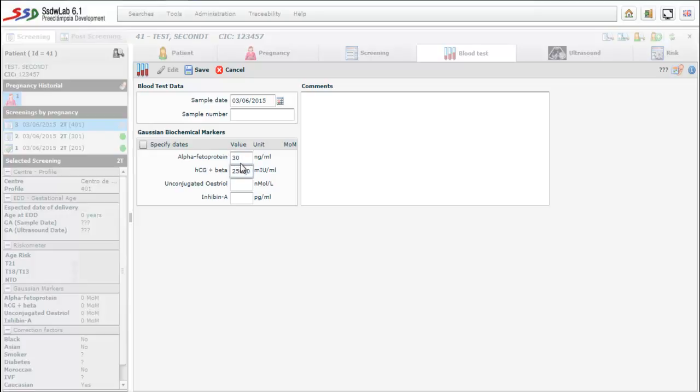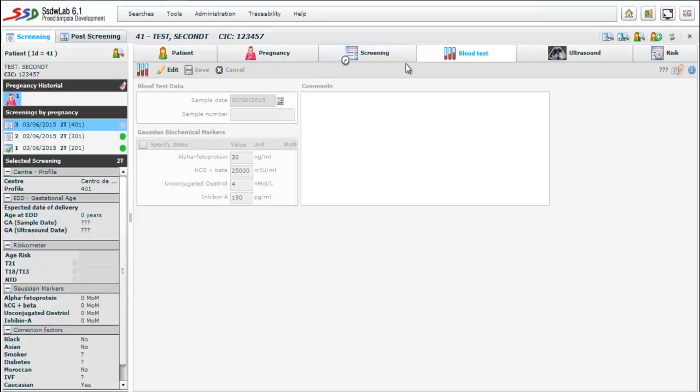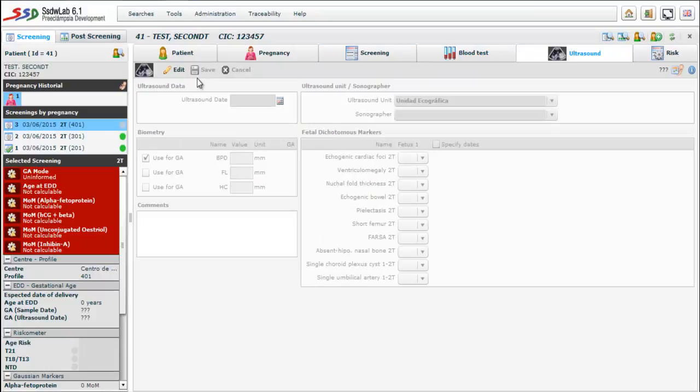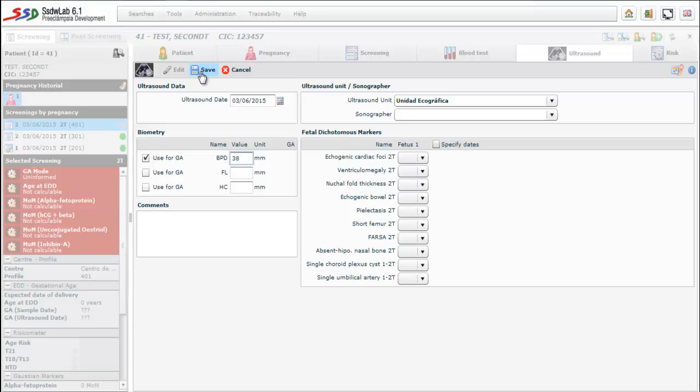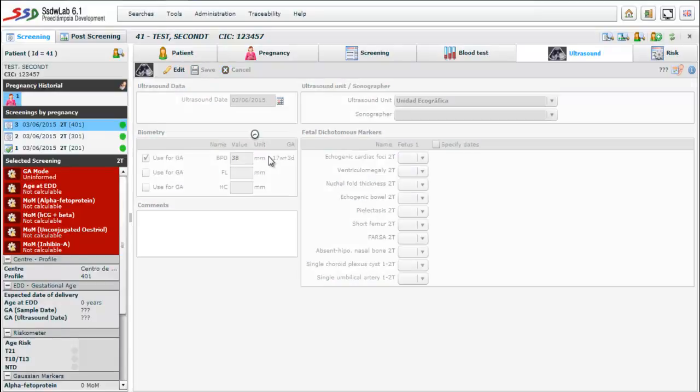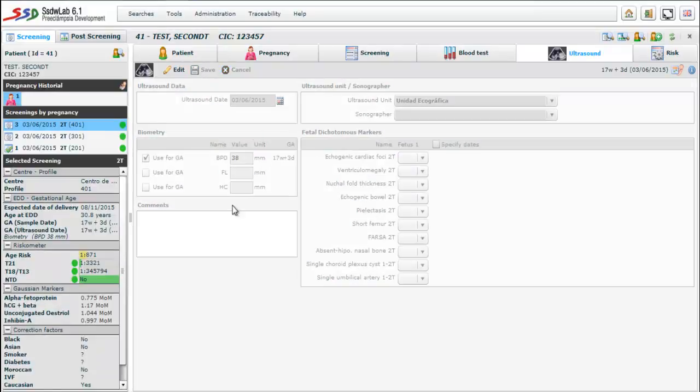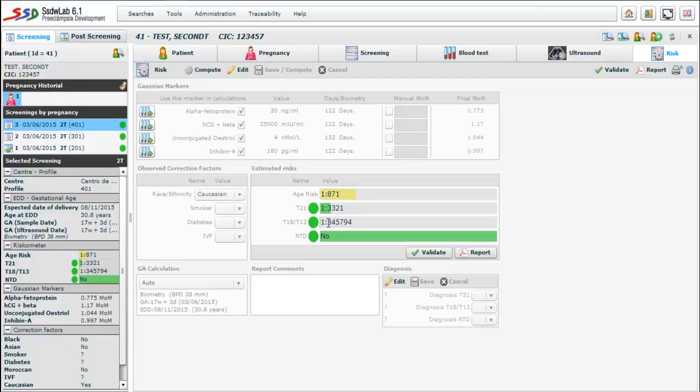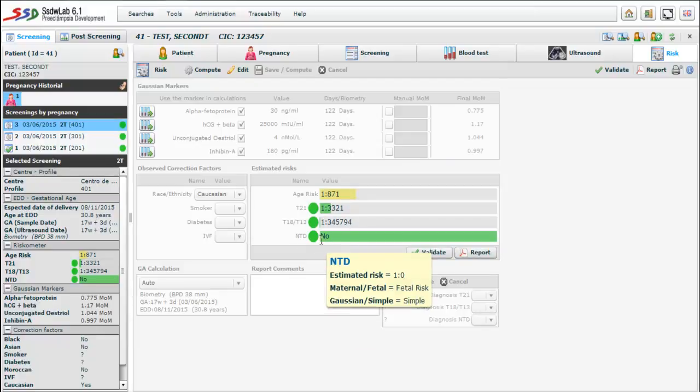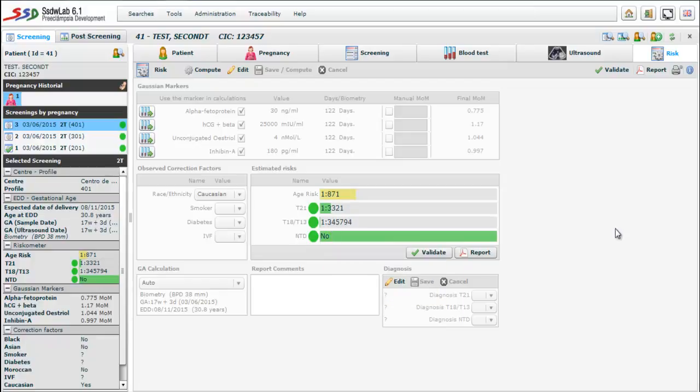We introduce the values of the Gaussian markers. In the next folder we introduce the value of the BPD used to calculate the gestational age. We observe that the gestational age is automatically calculated. Finally we go to the risk folder. As we have seen we can observe that the MOMs are calculated as the age risk and the final risk for trisomy 21, trisomy 18-13 and neural tube defects.